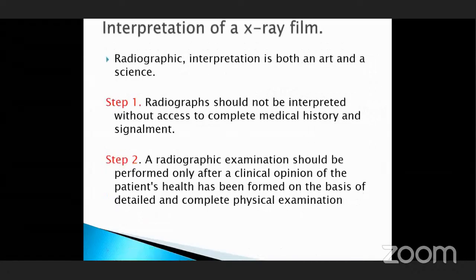Now, the interpretation of an X-ray film. Radiographic interpretation is both an art as well as a science. You cannot deny the experience. Knowledge can never replace experience. You must have sufficient experience of viewing and interpreting a radiograph to give a final diagnosis.